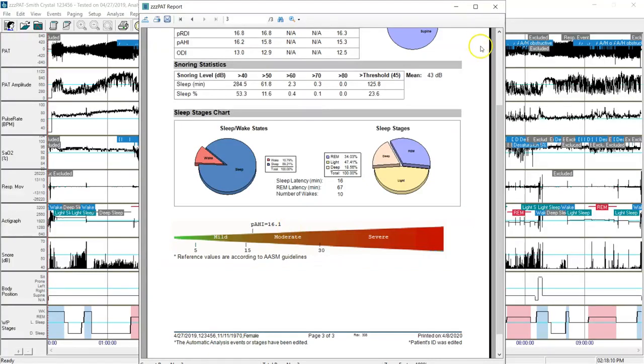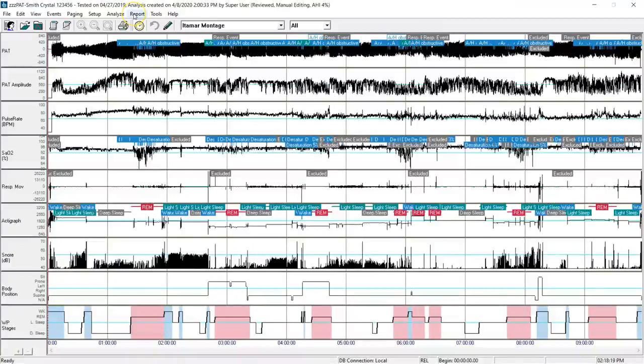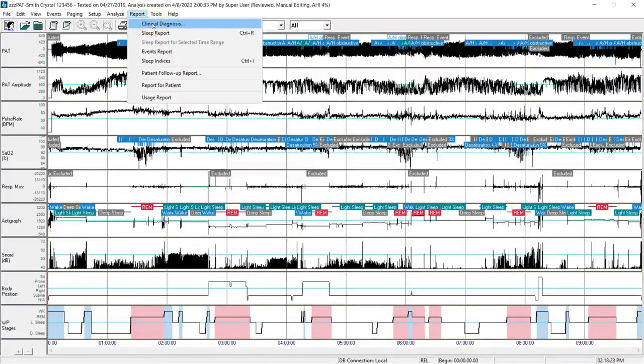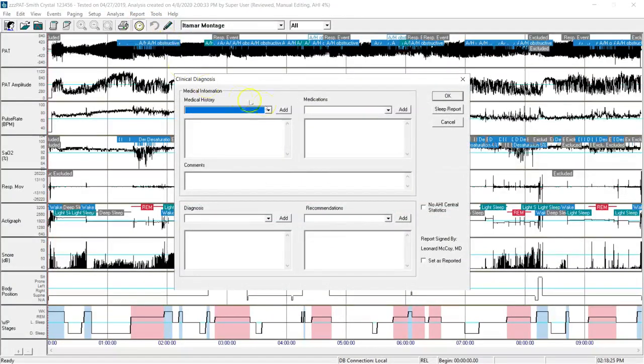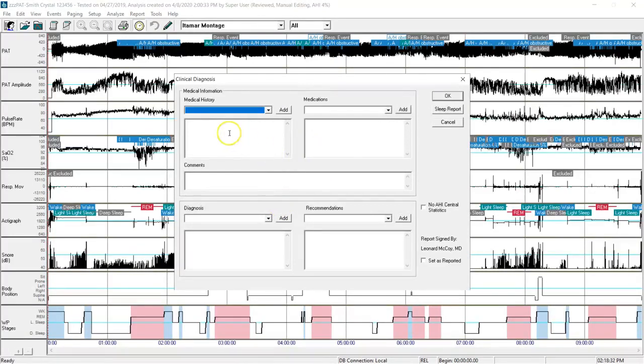I have a good understanding of what I want to put in the patient report at this point in time, so I'll either minimize or close the report itself. I'll go up to the top and click on report, and then clinical diagnosis.